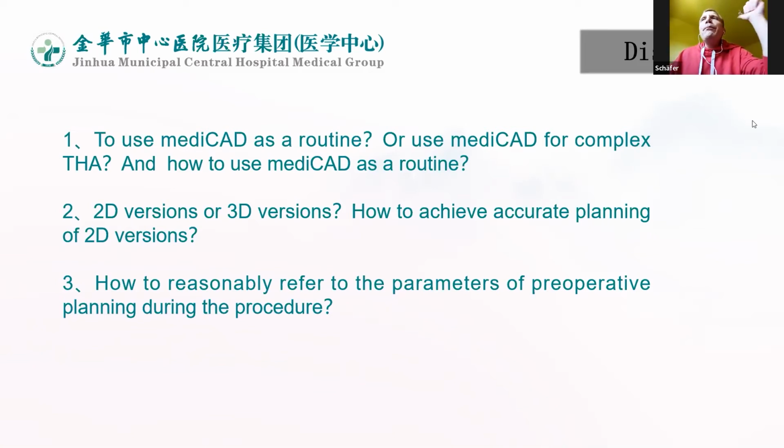You know almost 100% that you are going to use this stem from this company with this specification. From my experience, in 99% I will use the same instruments, the same size that I have planned.